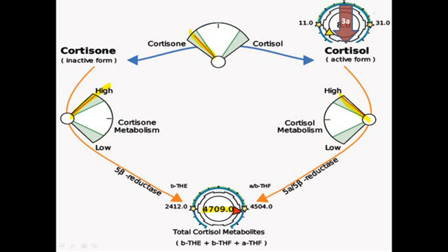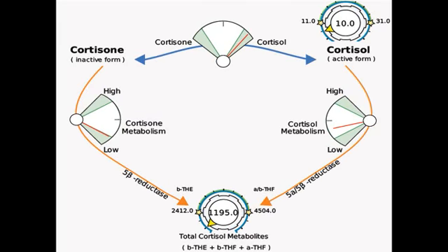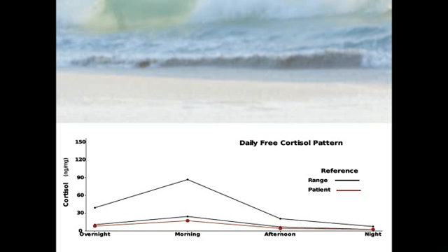So as this continues, oftentimes the cortisol metabolites will as well begin to come down, and then you end up in a situation where the patient truly is adrenally insufficient, where not only are they not making active free cortisol, but there are no cortisol metabolites much to speak of as well. So in this case, this person truly is not producing enough cortisol. But we want to be able to differentiate between the patients who are not making enough cortisol and situations where the metabolism has simply been upregulated, which we can see in obesity, hyperthyroidism, and long-term stress, where you're just exposed to cortisol so much that the body responds by, again, metabolizing that. So that's one piece of the puzzle.